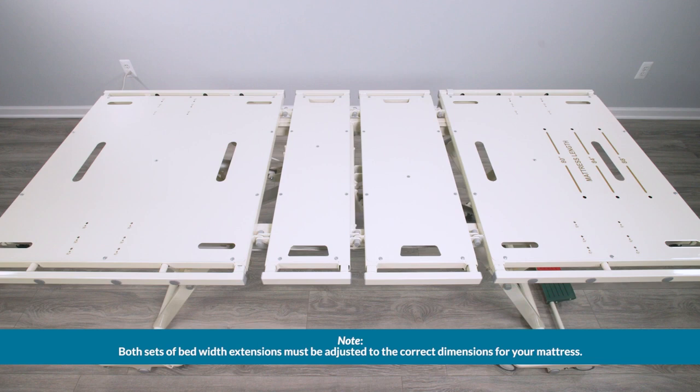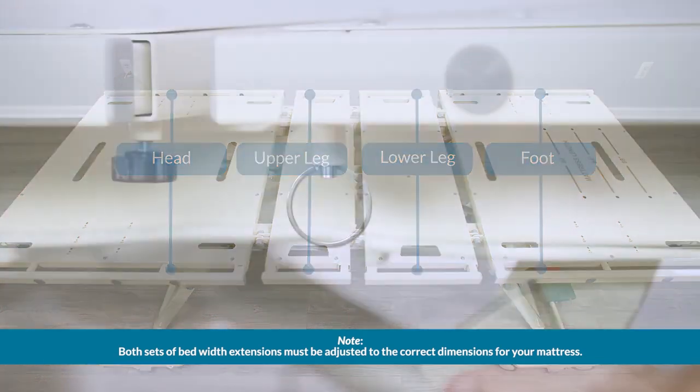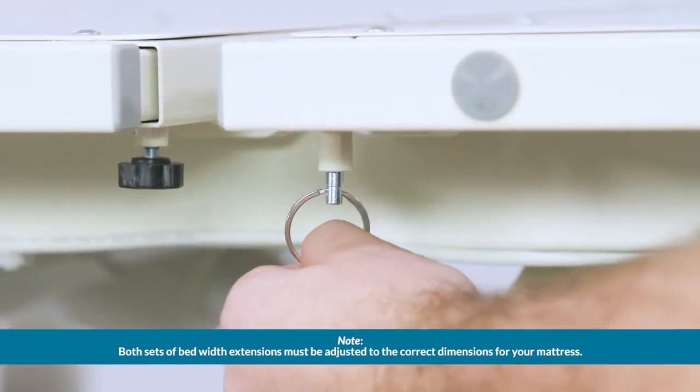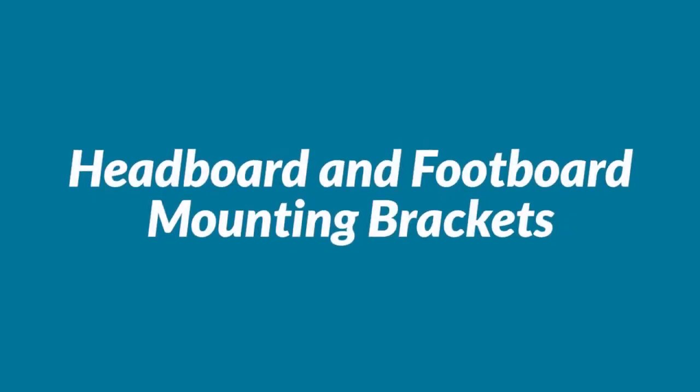Notice the bed width expansion bars installed on the HC-107. There are two expansion bars on each section of the bed: head, upper leg, lower leg, and foot. Each bar has an expansion pin and locking knob. Headboard and footboard mounting brackets.